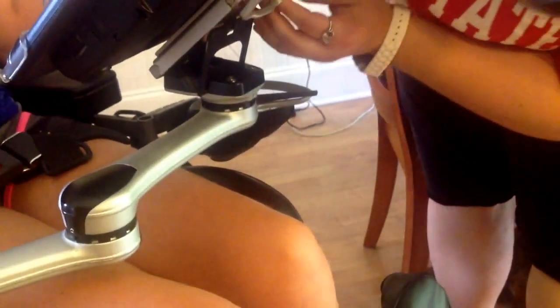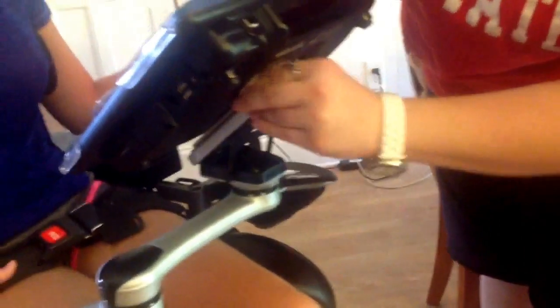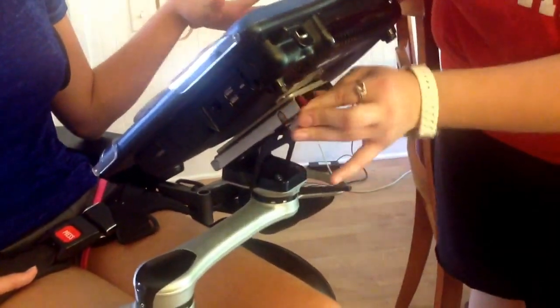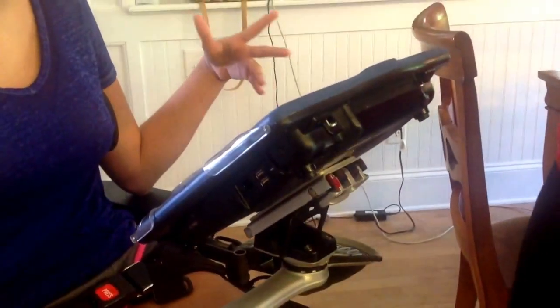And then there's a clamp that goes like that. And then there's a little red switch that very gently just gets turned towards you. There — so now it is secure.